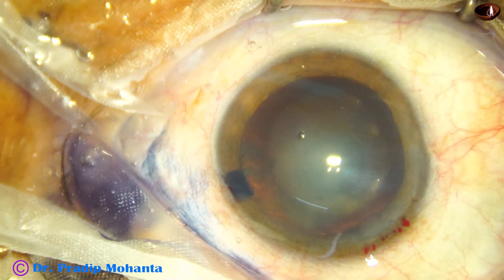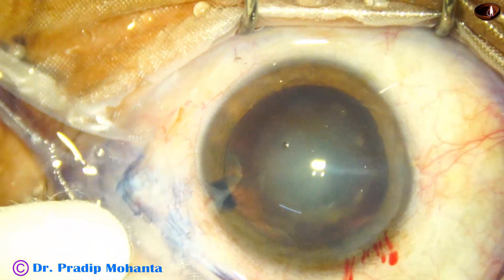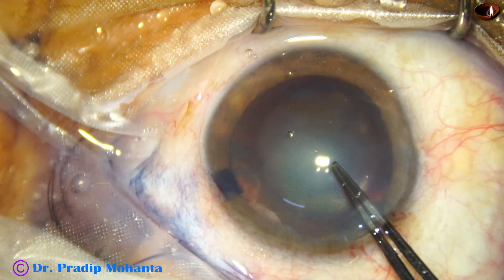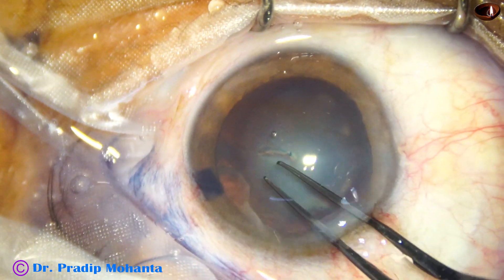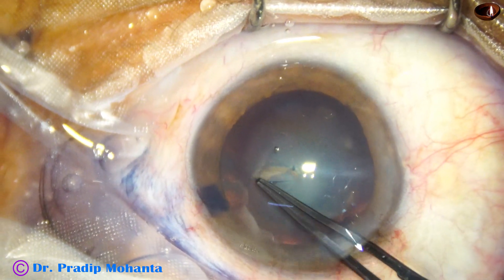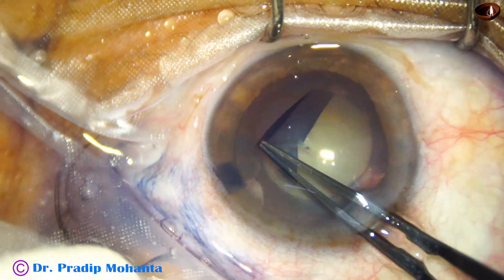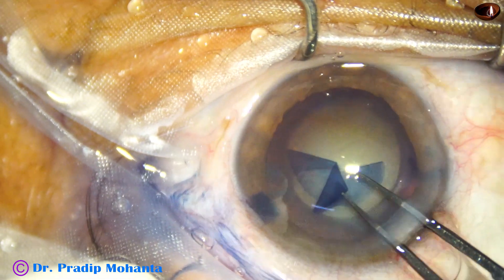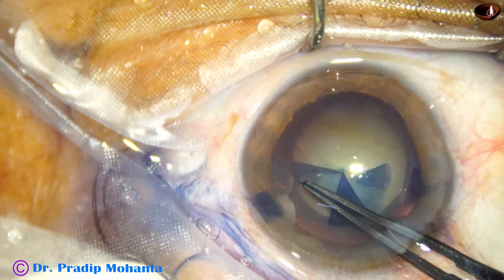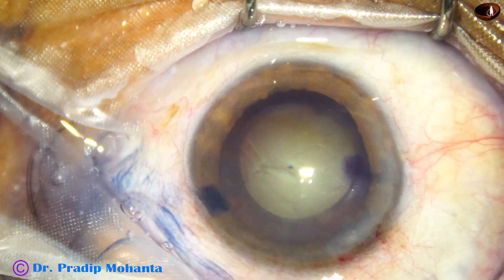The anterior chamber is filled up with 2% HPMC. Now, capsulorhexis is done with the help of utrata forceps. One can use a cystotome to do the rhexis, but we should learn utrata forceps because in intumescent cataracts, we must use utrata forceps.